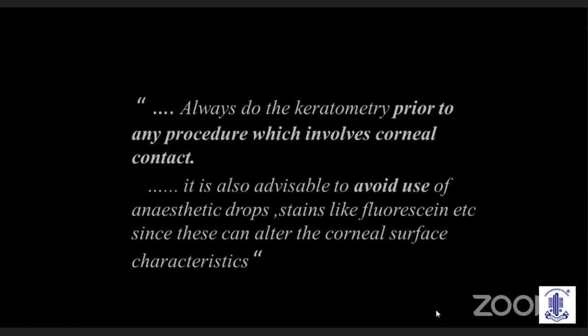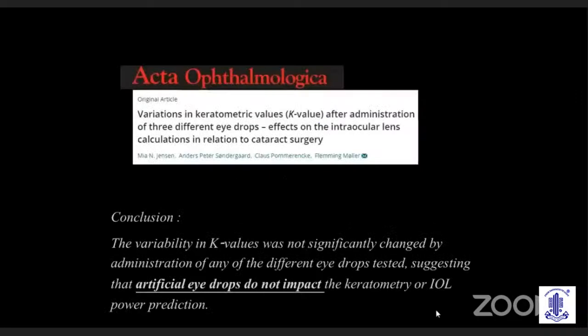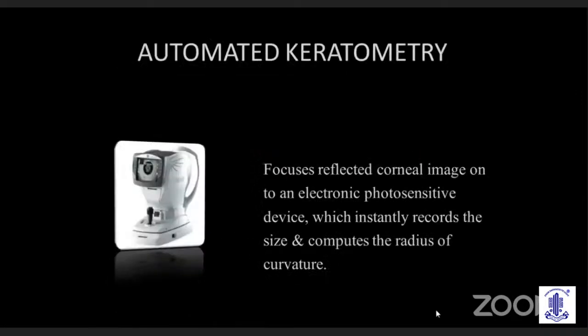It is also advisable to avoid use of anesthetic drops and stains like fluorescein, since these can alter the ocular surface characteristics. It's good to actually use artificial tears.